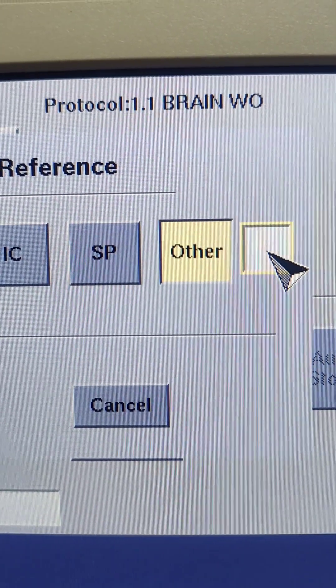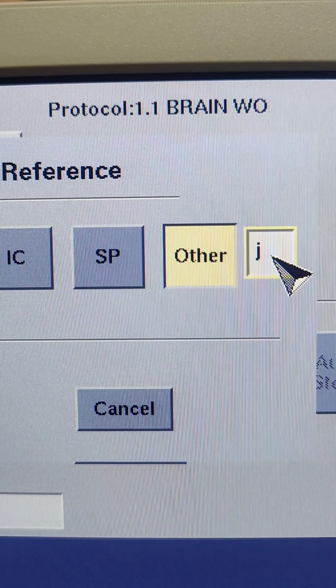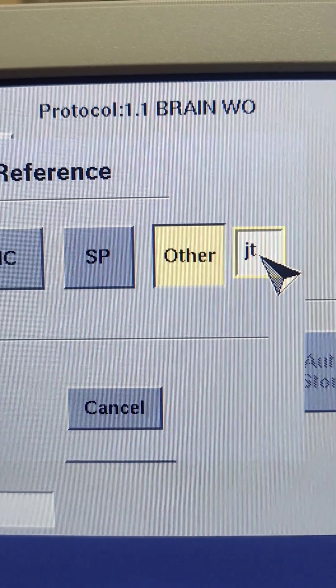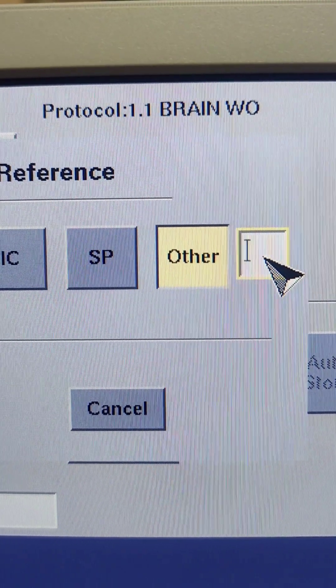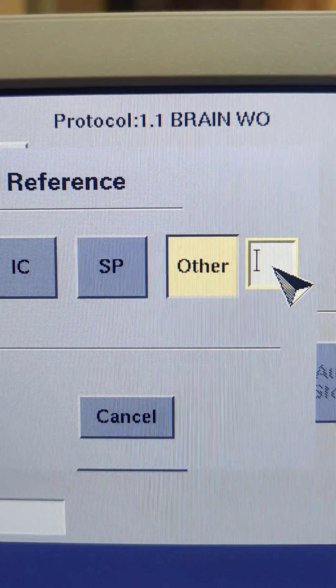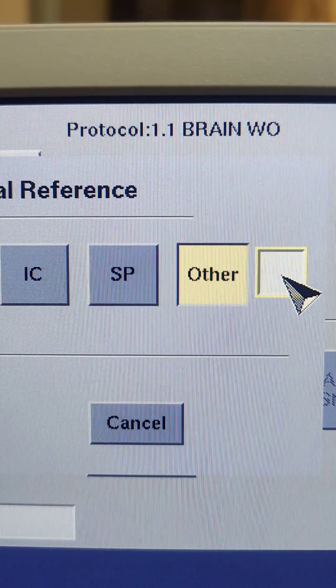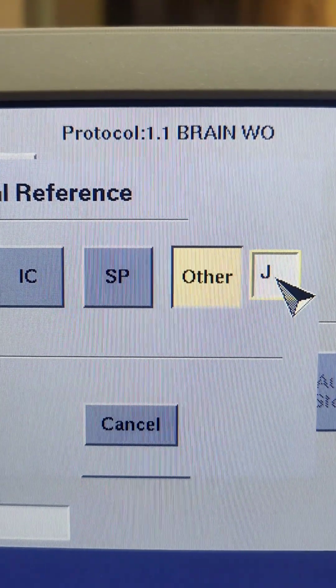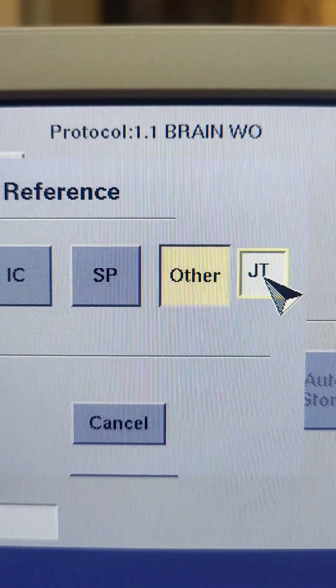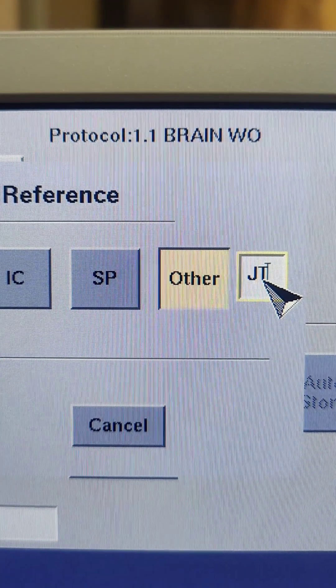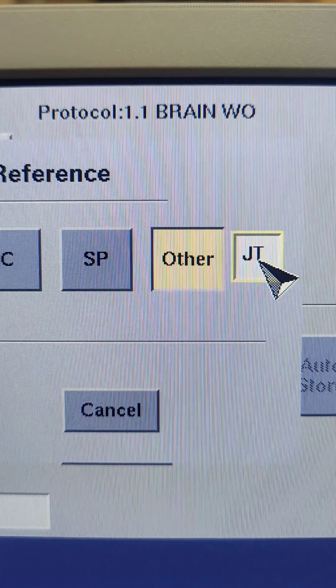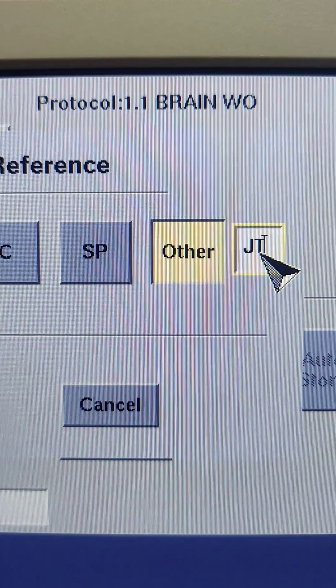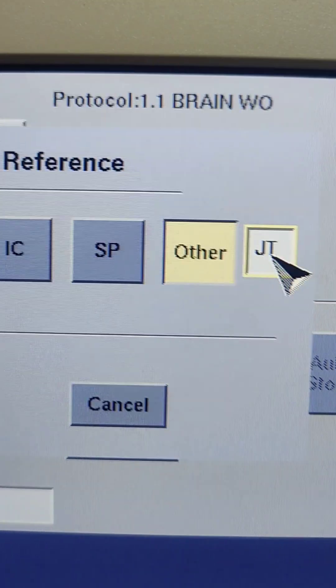And here are the anatomical references that we use. The OM is normally what we use for a head scan and things like orbits, C-spine, maybe maxillofacial sinuses and whatnot.